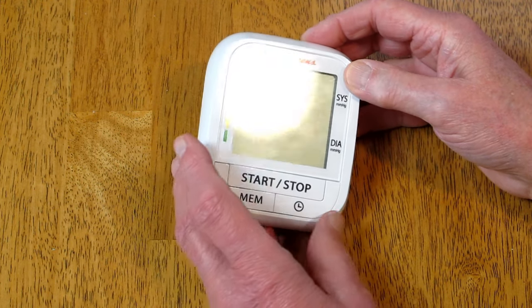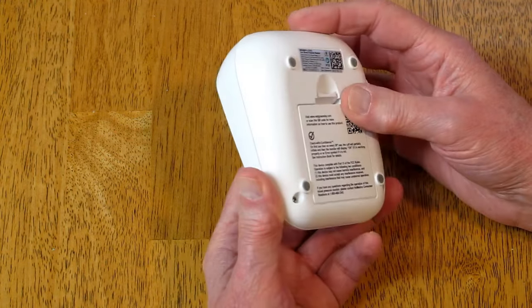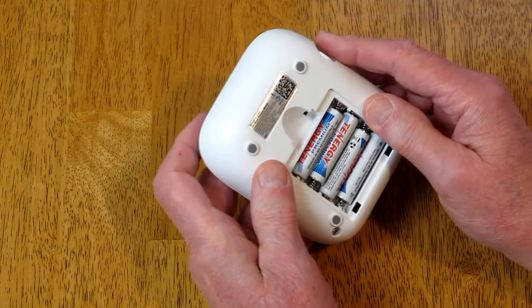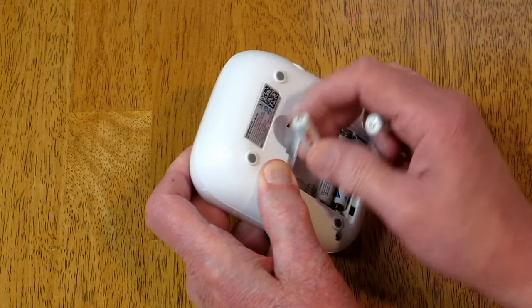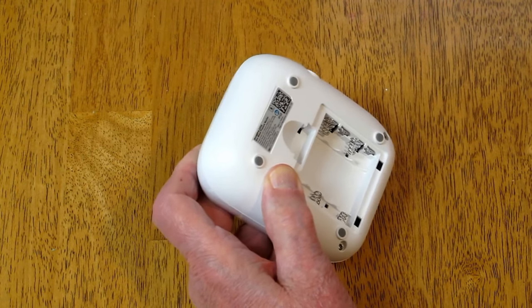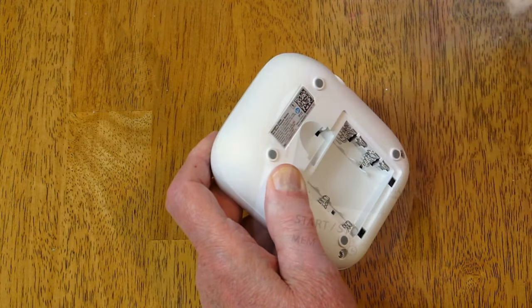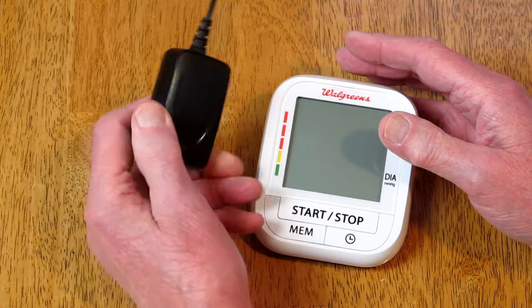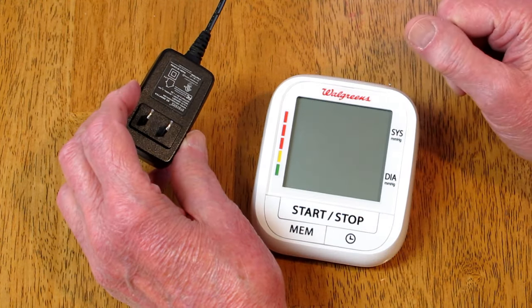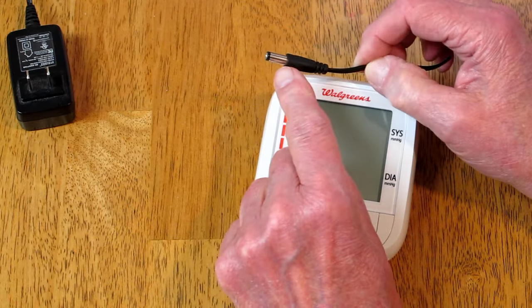I bought a new blood pressure machine at Walgreens and unlike my previous one, this does not have a way to use an external power supply. These now use small AAA batteries and they do not last terribly long — the rechargeable ones don't last too long either between charges. This is a wall power supply I had for the old blood pressure machine and I intend to use it for this one. The problem is this connector is not a standard size — it's six volt, one amp.